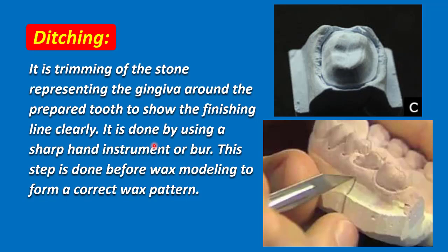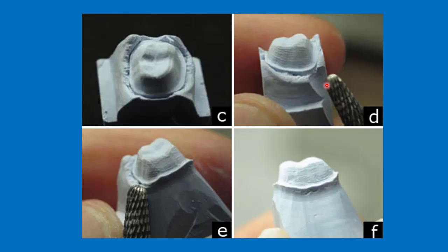This step is done before wax modeling to form a correct wax pattern. As you can see here, this part of stone represents the gingiva. In areas, it covers the finishing line, so it must be removed so proper access to the finishing line can be achieved. It can be removed by prosthetic burrs, but care must be taken not to hit the finishing line. As you can see here, this is the finishing line very clear.